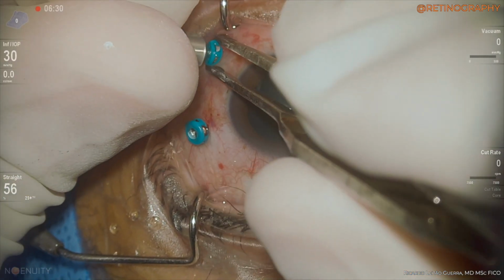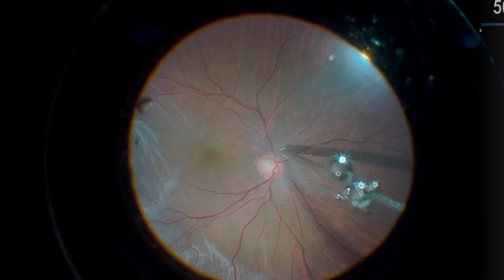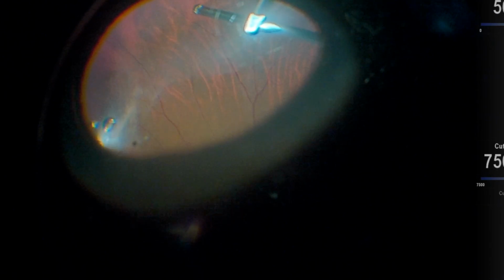After the placement of 25-gauge trocars and the Chandelier, the surgeon performs a core vitrectomy. Next, he engages the posterior vitreous near the nasal margin of the disc and moves the vitrectomy probe towards the more peripheral region, increasing the vacuum to induce posterior hyaloid detachment.